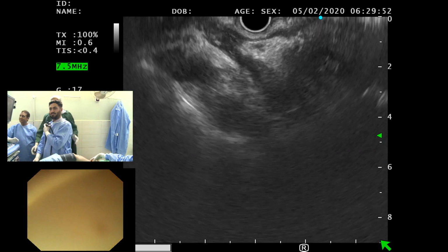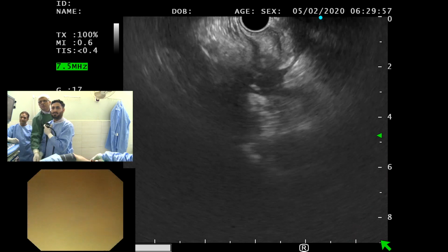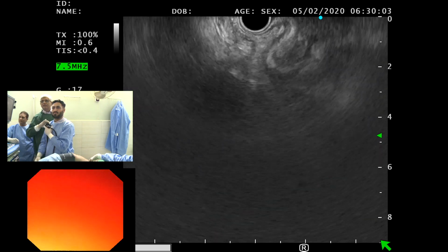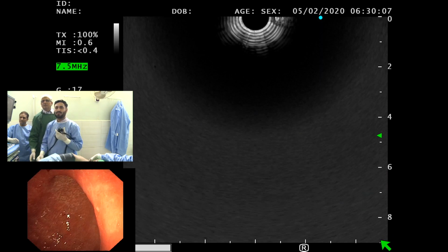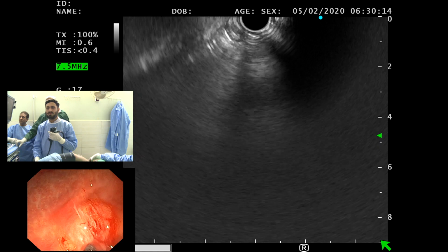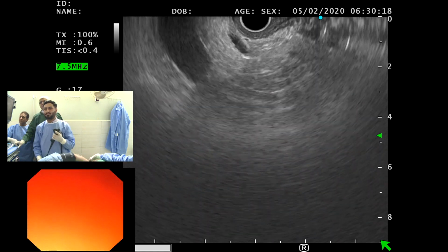So now what I do is I fall back, so you can keep coming. If you want to do what Khalid does, where he can fall back and start looking, scope up, let go of it, because you want to take the scope back out. Yeah, you can go back to the tip up, tip down, no.